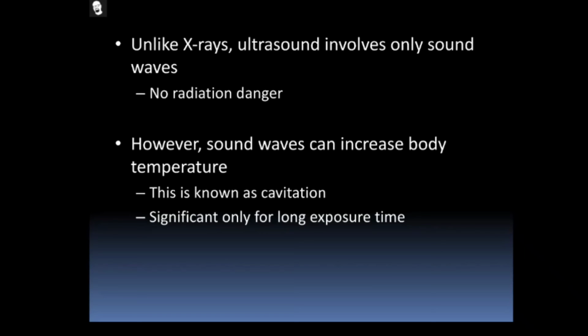Most probably, for kids under the age of 13 or 14, the doctor first of all suggests ultrasound only. If the doctor is not able to diagnose what happened in the internal organ, then he suggests some other imaging technique, especially X-ray or CT. The last option is MRI. Why? Because I'm talking about small-aged people, the kids and some elderly persons, because the MRI scan, because of the magnetic field, produces noisy sounds. That noise will irritate the patient.